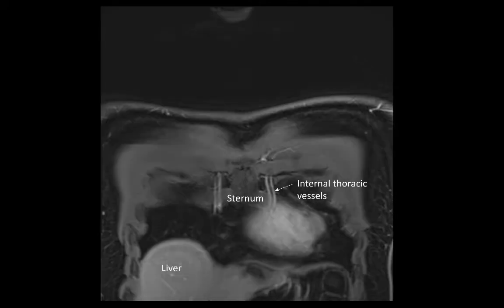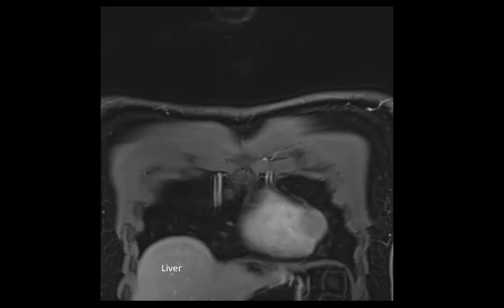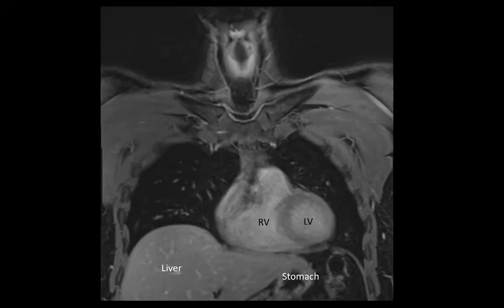More posteriorly we can see the right lung and the heart, and now we can differentiate the left and right ventricles of the heart. Now we can see the right atrium coming into view. We can see the tricuspid valve between it and the right ventricle. We can also see the continuity of the right ventricle with the pulmonary trunk.